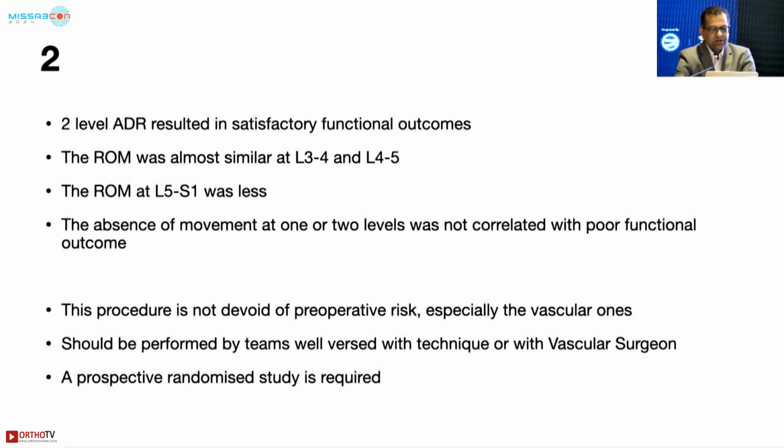The procedure is not devoid of any kind of pre-operative risk, especially the vascular one, and if you're starting early, then you should have a vascular surgeon with you. We still need a prospective randomized study in multi-level ADRs.